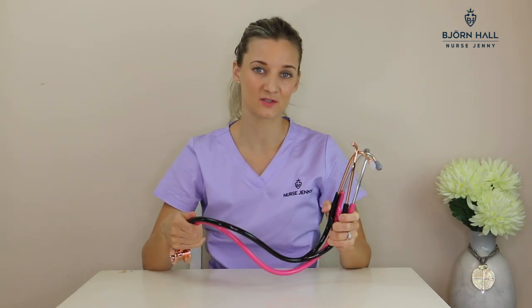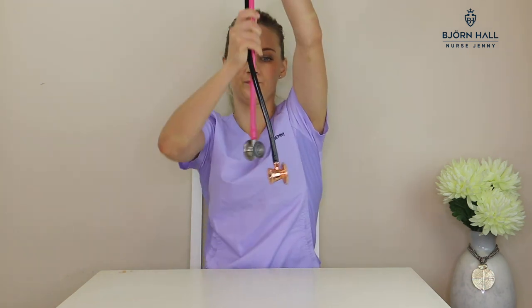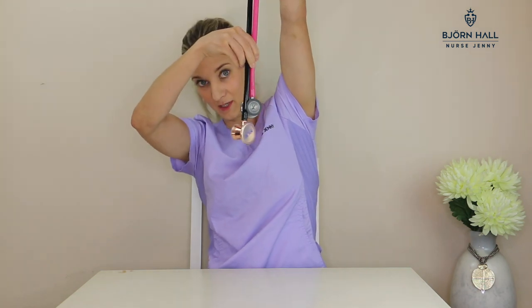Tubing length: the MDF stethoscope is 75 centimetres long which is 29 inches, and the Littmann is 69 centimetres long which is 27 inches. The difference is that much.